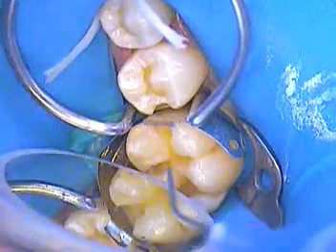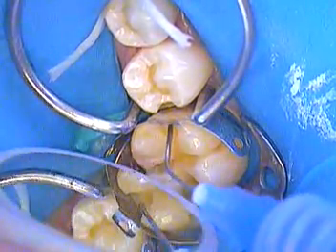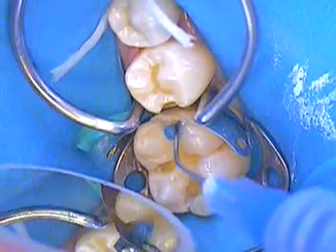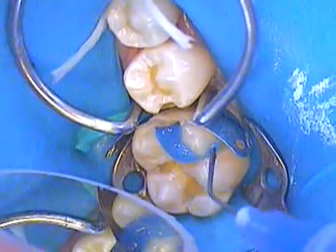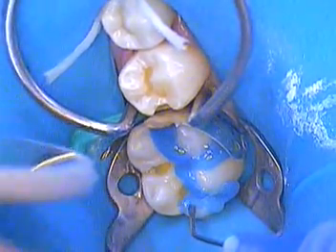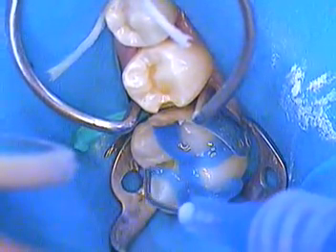I've placed the liner and the composite type setup, so now we're going to go ahead and etch our tooth. I'm going to etch the enamel first all the way around, and then I'll come right on in and etch the dentin.